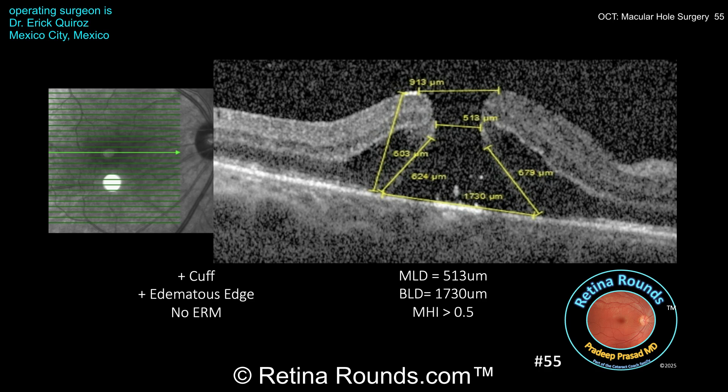Obviously, factors like chronicity and other ophthalmic comorbidities are going to play a role with respect to outcomes. As I look at the OCT for this patient, a few features stand out. First, the size of the macular hole — defined as the minimum linear diameter, or MLD — is the minimum distance between the edges of the macular hole. In this case, that's measured at 513 microns, so this is a large macular hole.